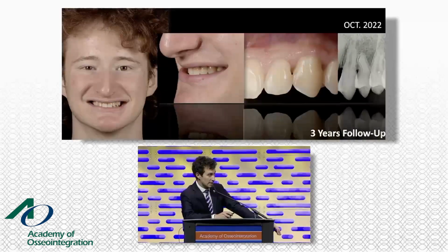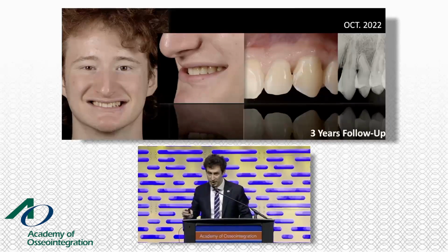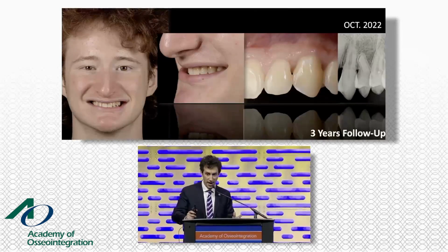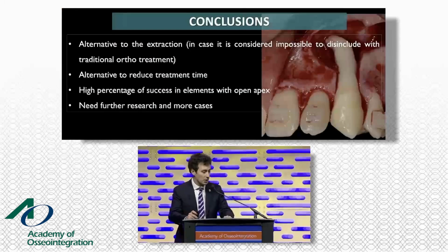So this is Davide nowadays. Someone of you can ask me, will it resorb? Yes, this is a chance. This is a possibility. But if it were to be resorbed, I will have gained time for our patient, and I will do an implant when he is older, 30, 35, who knows when. And gaining time, moreover, I have already reconstructed our tissue during the primary surgery, and I will maybe be able to do a post-extractive implant. So I'm going to conclude.